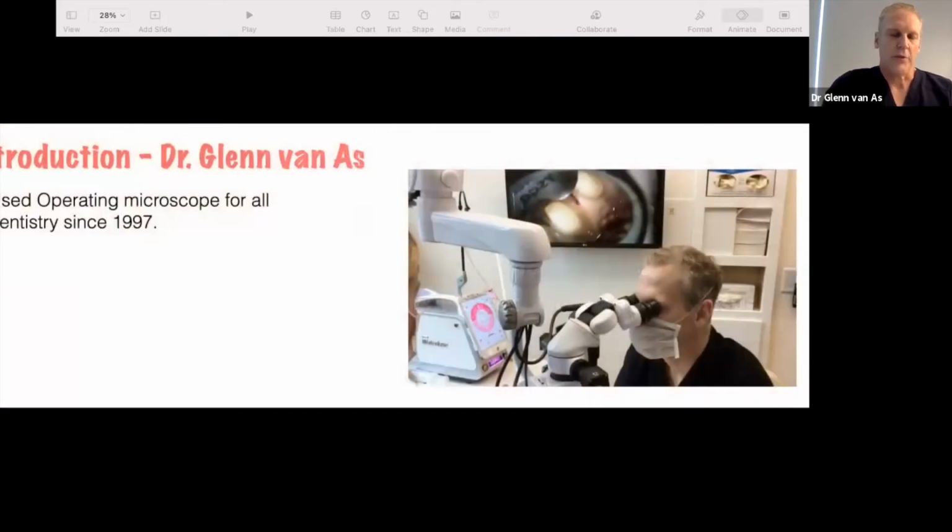I began using an operating microscope in 1997. I've been in practice for 34 years, and I do all my work through an operating microscope. We have 9 ops, and I have 9 scopes, and I do all my work through it. Not saying you have to, but that's how I get my video and stills. So you can see here a laser being utilized for crown troughing.